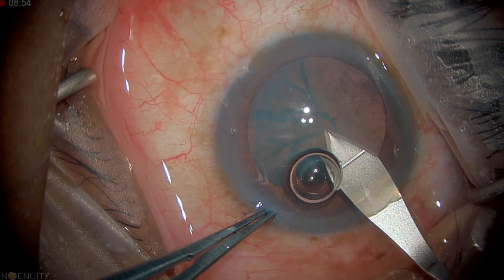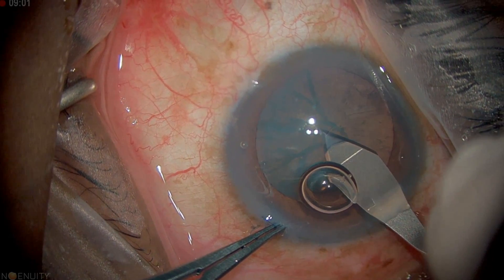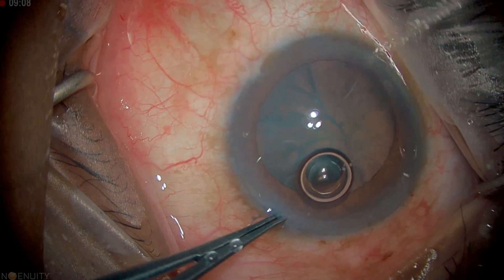Now here I could use a cystitome, but what I'm going to do is redirect my knife and enter directly into the anterior capsule. I'll come back to the same plane so I don't extend my wound any more, and that way I don't need a cystitome. Then I'll take the capsulorhexis forceps.